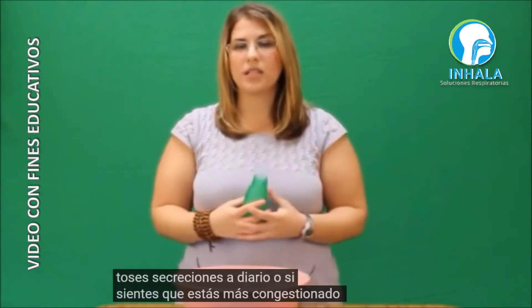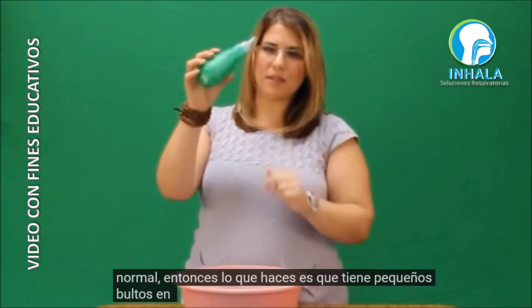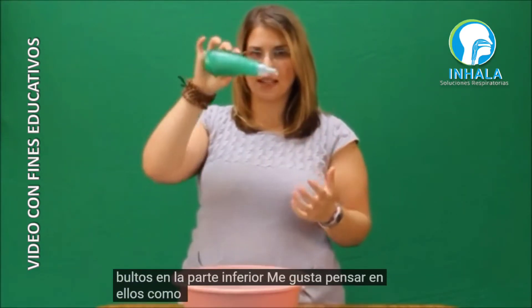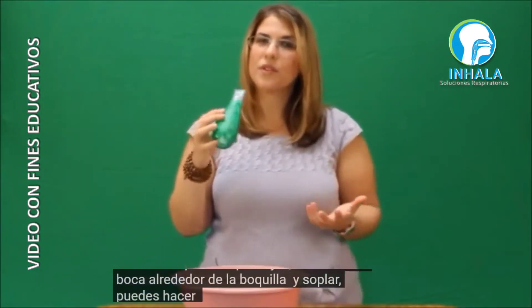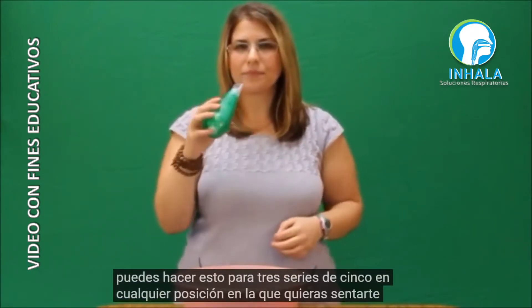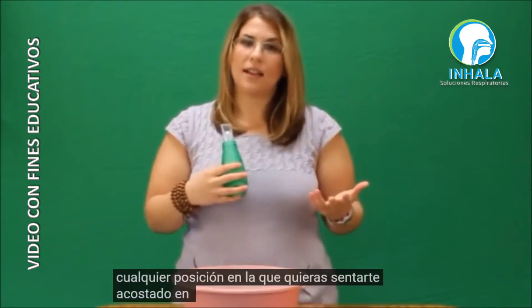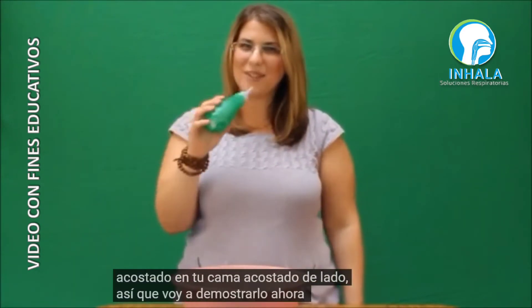Or if you feel like you're more congested than usual. It has little bumps on the bottom — I like to think of them as legs — those go down. You wrap your mouth around the mouthpiece and blow. You can do this for three sets of five in any position you want: sitting, laying in your bed, or laying on your side. I'm going to demonstrate right now.